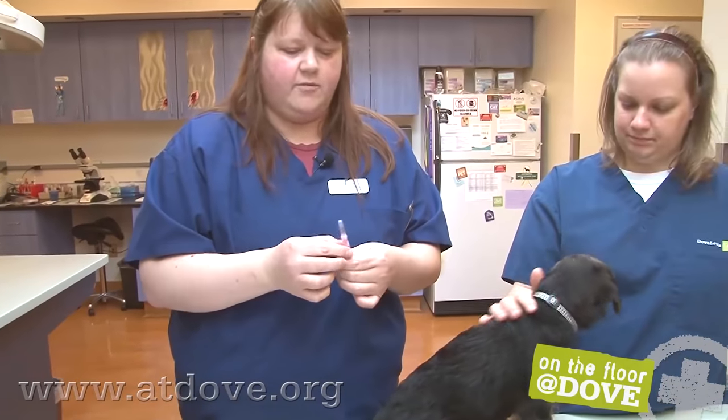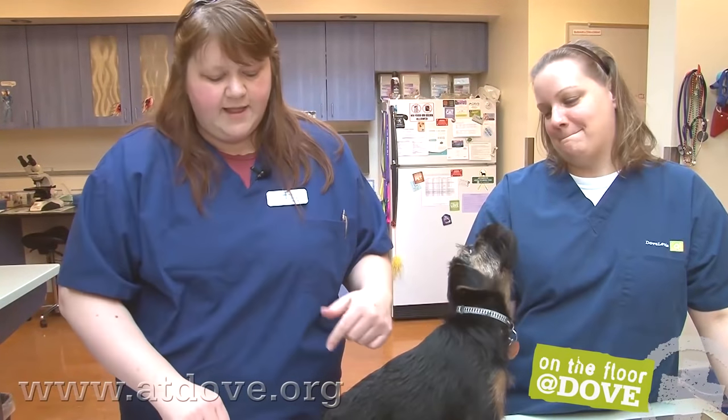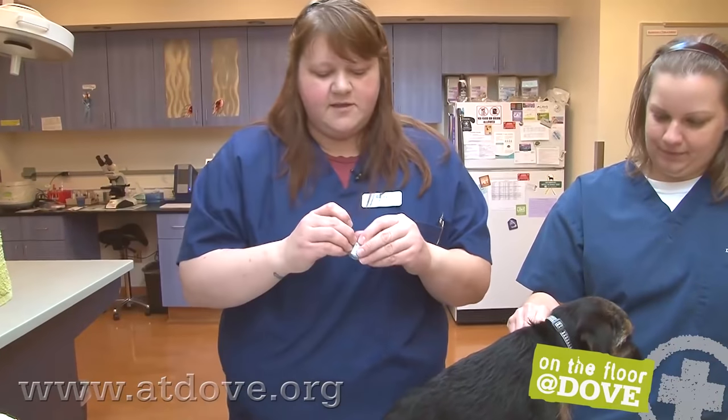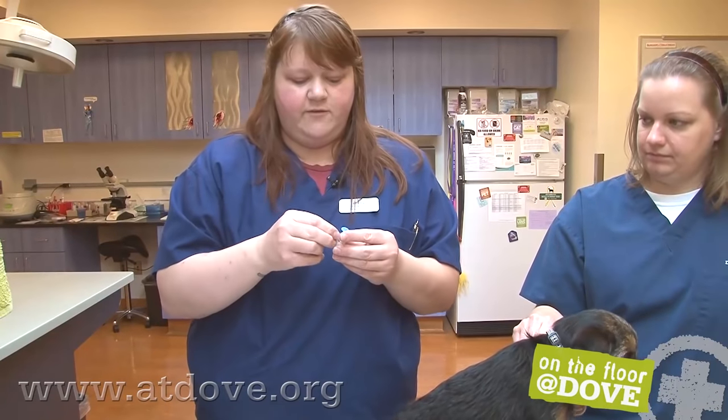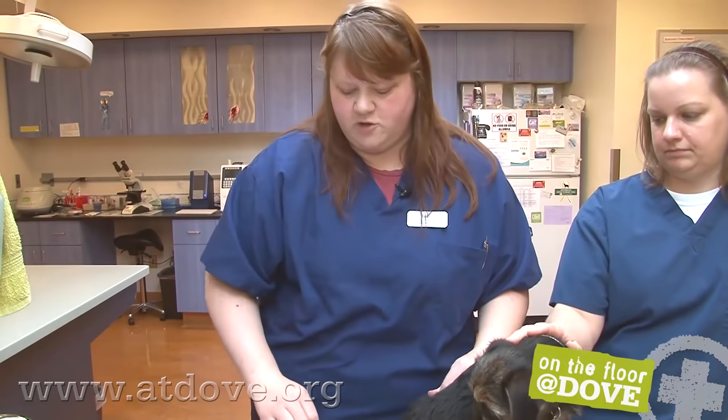He's such a little guy that we're going to go with a 25-gauge needle. I'll go ahead and draw up the Bordetella as well so we have both ready. Because these little labels peel right off, if we're giving more than one vaccine we'll just peel it off and put it right on the syringe so we remember which one is which.